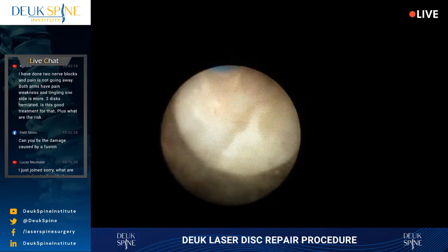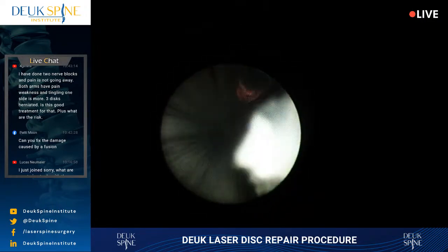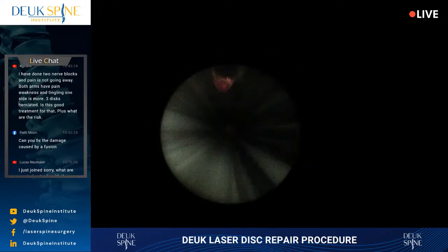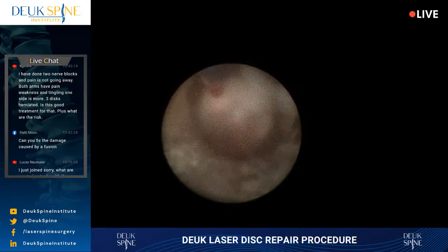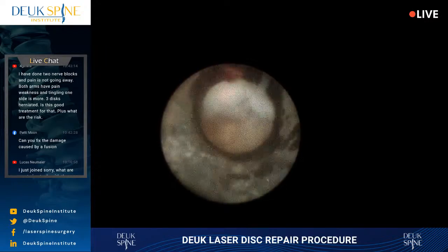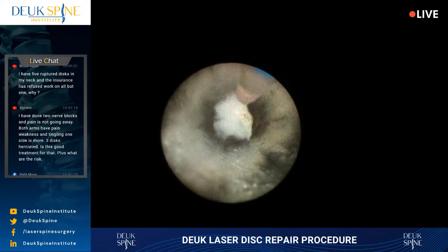Once I started doing the laser surgeries 15 years ago, we never had any of those complications. As a matter of fact, I've been doing this surgery now 15 years with 0 complications. 0. I don't like talking about it during surgery because I might jinx myself, but we've literally had no complications. We published 0 complications back in 2012, 2013, in the National Library of Medicine and Surgical Neurology International. And even to this day, we've had 0 complications with these surgeries.